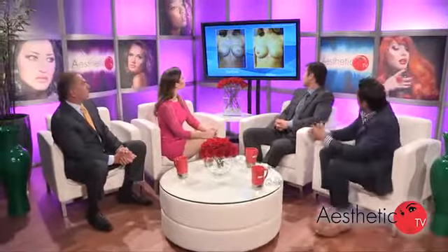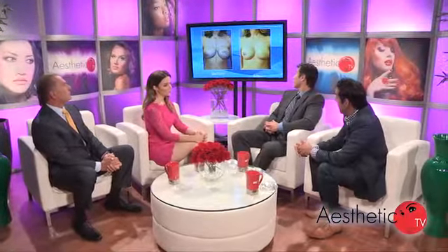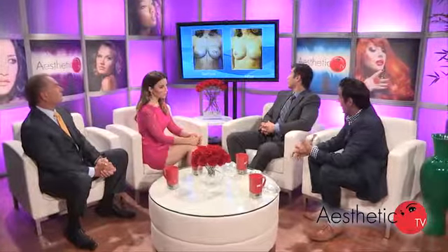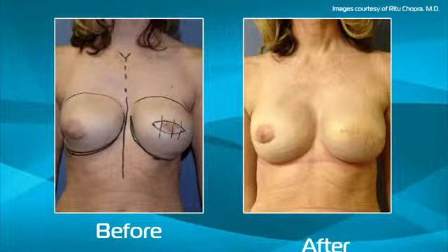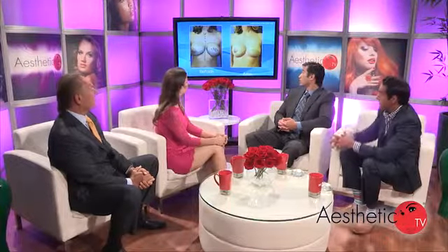Let's take a look. So this patient is a 48-year-old who had cancer on the left side and wanted a prophylactic mastectomy on the right side to protect her from getting cancer in that breast. And so what I did with this patient is called a tissue expander alloderm reconstruction, where at the first operation I put tissue expanders in and I fill them up until she's happy with her breast size. The next operation I come back in and I put implants into her.